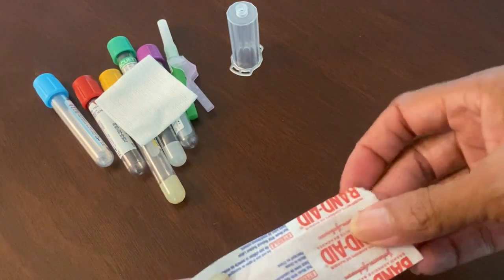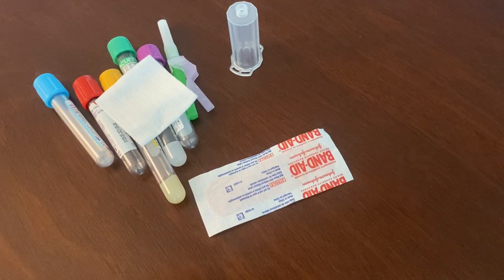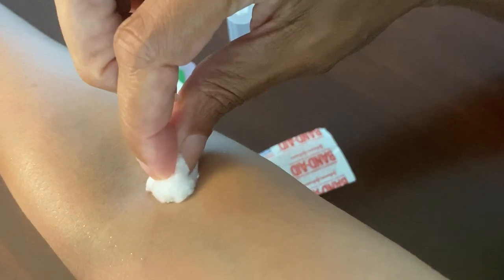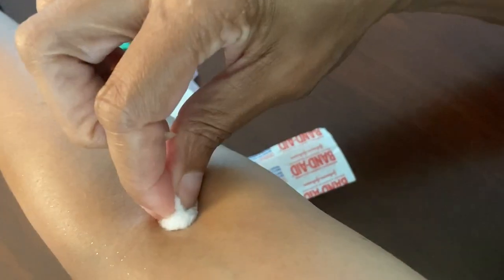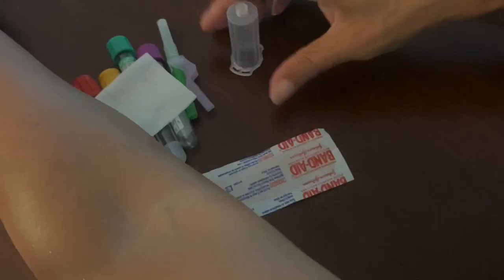Go ahead and turn your notification bells on so you don't miss any uploads. Now let me grab my cotton ball and cleanse my site. I still recommend with your alcohol prep — start in the middle and go outward. I know the new thing is to do the swipe, but I don't understand that, because you want to clean outward. Dirt and oils sit everywhere, so why not cleanse the whole site?